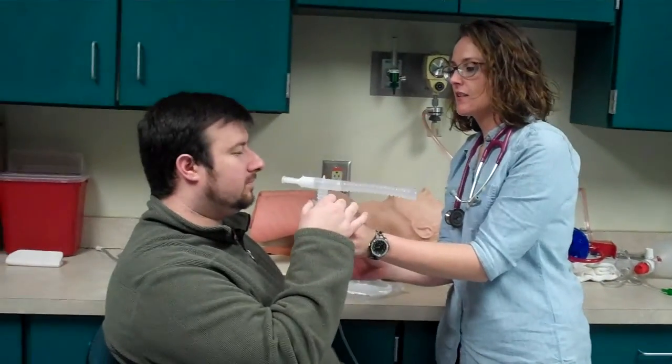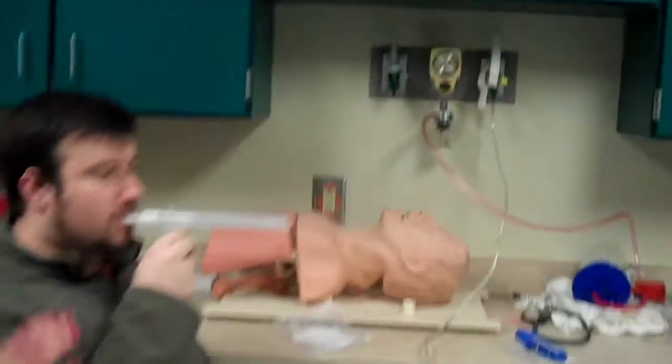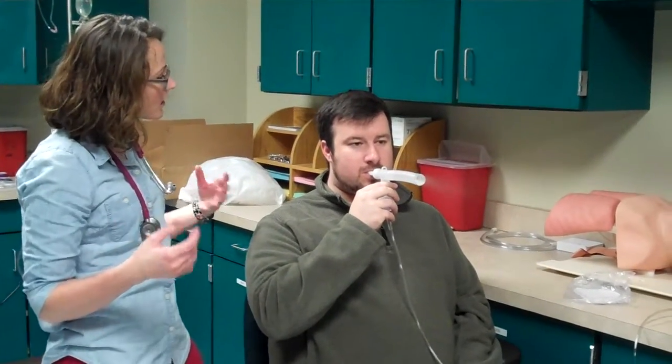Alright. And we'll put that in your mouth, and you're just going to take some normal breaths. I'm going to come on this side. Just breathe normally. Good job. Alright, in a second, I'm going to tell you to take a deep breath in and hold it. And then when I tell you to let it out, then you can let it out, okay? You feeling alright? Alright, let's do this.